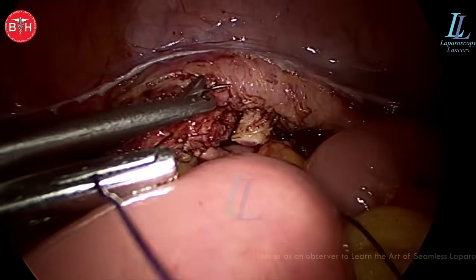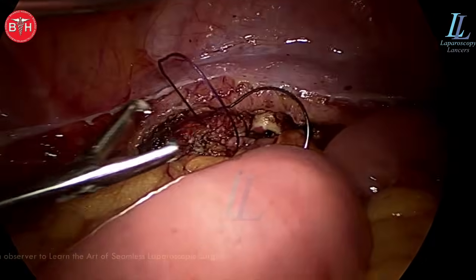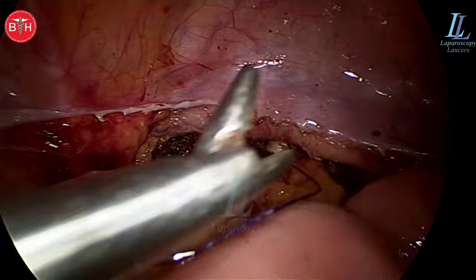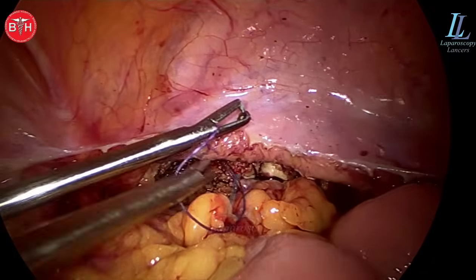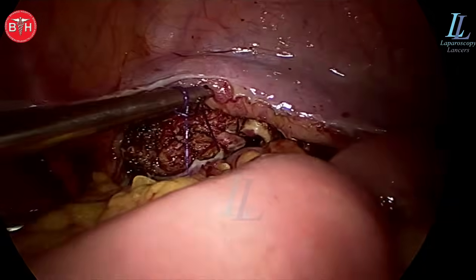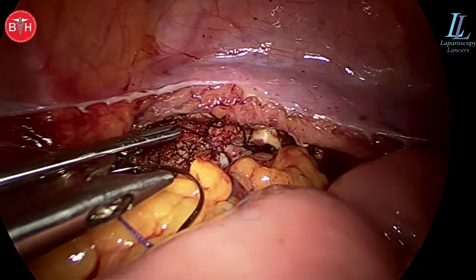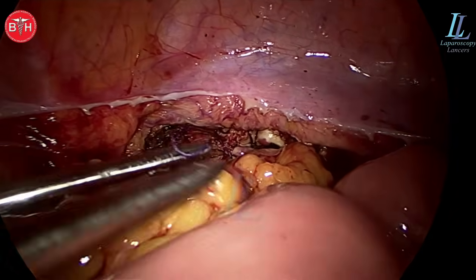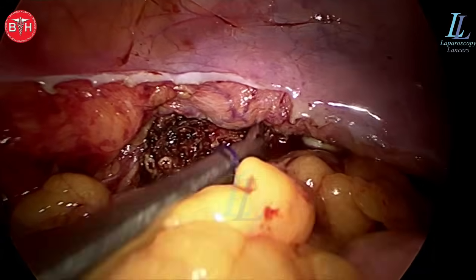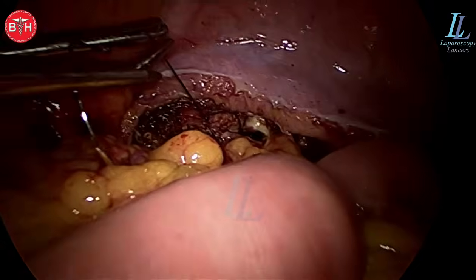Learning suturing is very important — please go ahead and buy an endo trainer and start suturing. But the first thing to learn is not suturing: start by putting a lead pencil inside and hold it and write A-B-C-D or draw straight lines in the endo trainer, that's all that is required. Suturing will automatically come because once you have hand-eye coordination and your brain is working with it, the suturing will happen. The corner sutures have been placed and the surgery is complete — the blood loss is almost nil.